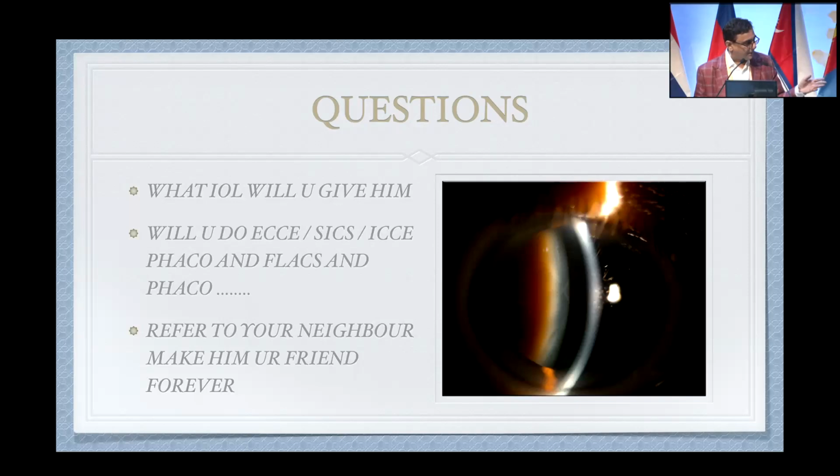Or you'll refer to your neighboring best friend and make him your best friend forever? I would still attempt a Phaco, sir. If it's a well-dilated pupil, and if the bag is not too weak and pseudo-exfoliation is not there, then it's likely a good bag. Likely that Phaco is still very much possible.